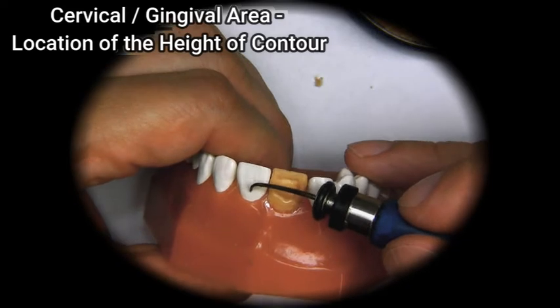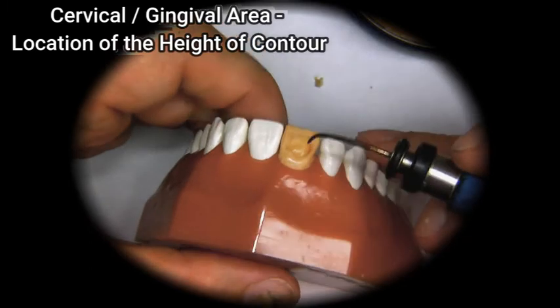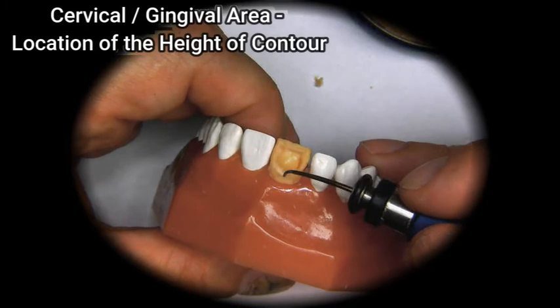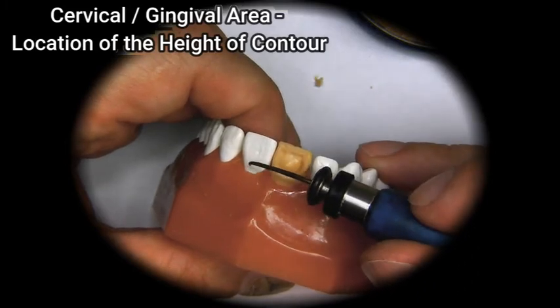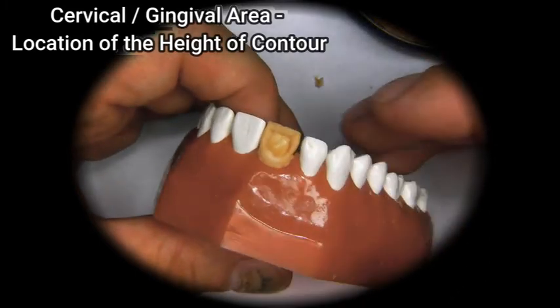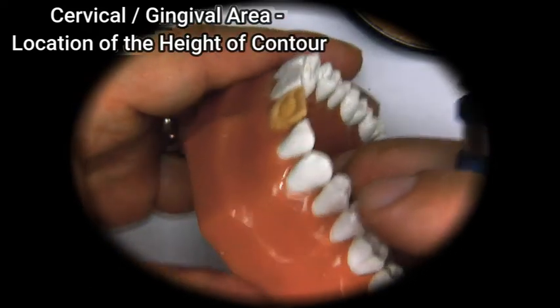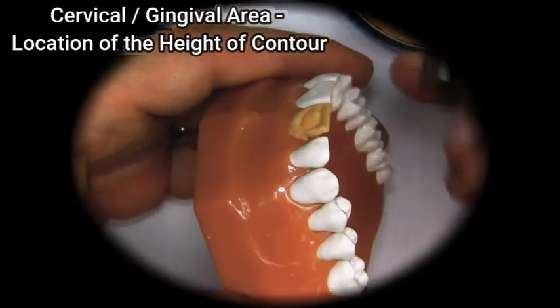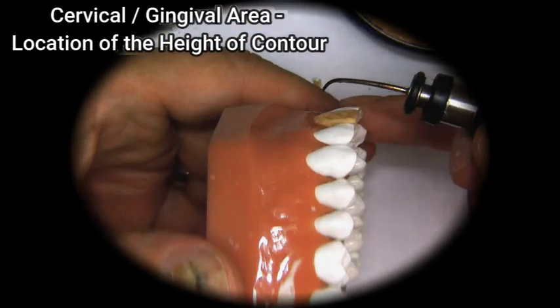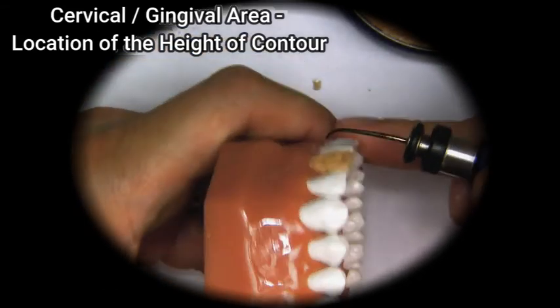Now this tooth here is a tiny bit too flat to my taste, so we're going to do a slight contour here that's less flat than number 9. So if we look at it, it's going to come out slightly more. Now the general rule of thumb is that the height of contour here should be about the same height as the gingival aspect here.